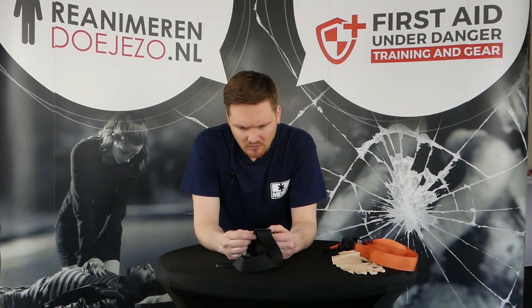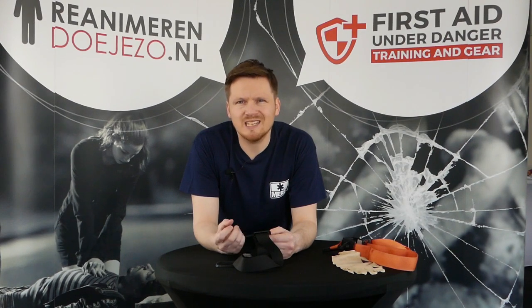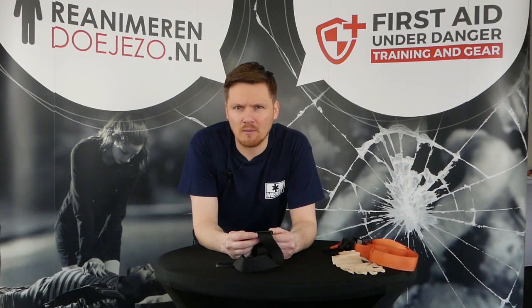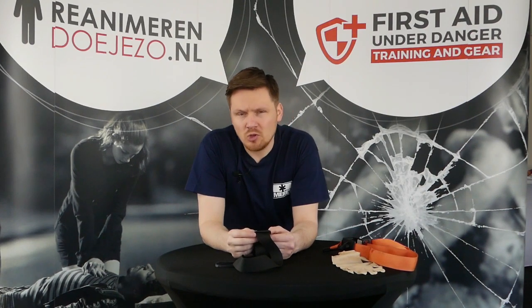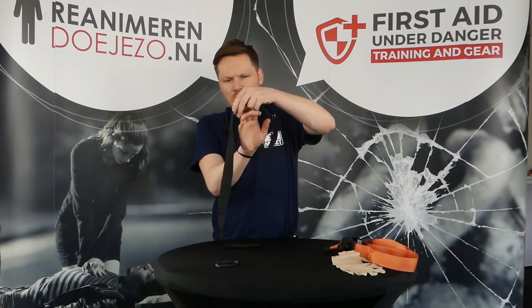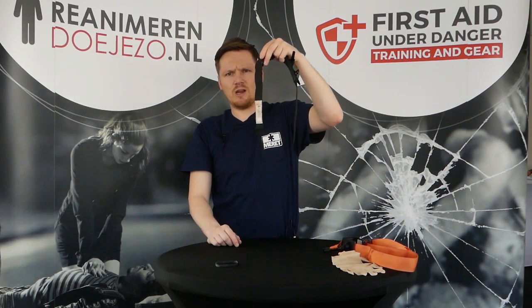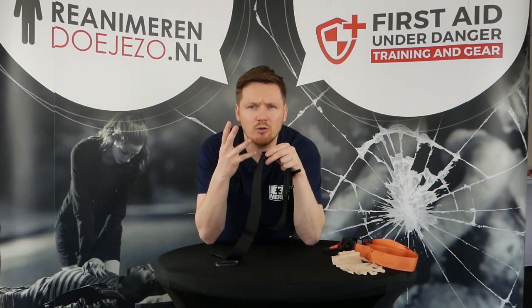Still, and I need to be honest, I do believe that for self-application, because it is double looped, it still isn't as easy to do as with the Combat Application Tourniquet. I do believe that it can get as easy, but you need more training and more preparation. For self-application, you really need to prepare your tourniquet in the right way, because if this is too long, you're going to have a problem with self-application. So you really need to think about your gear and how you're going to use it.